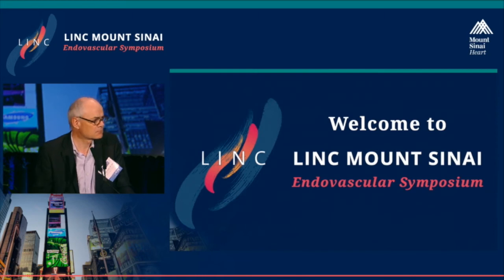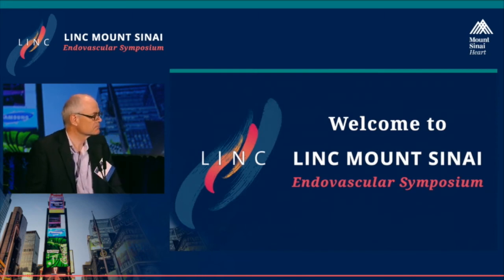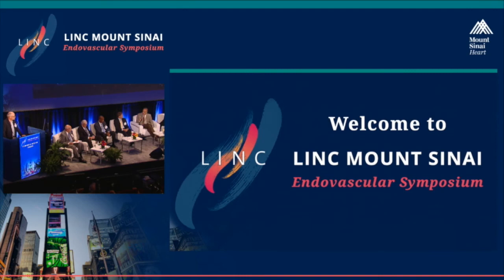So there's one other, that's an excellent case. One other piece of information, you mentioned it wasn't approved in the U.S. It actually is cleared for use in the U.S. and commercially available. The trial's being done to look at comparisons and look at DCB effectiveness, as well as gather economic data. So the trial is actually a very important trial, but the device is actually available off trial use. Okay. Thank you.